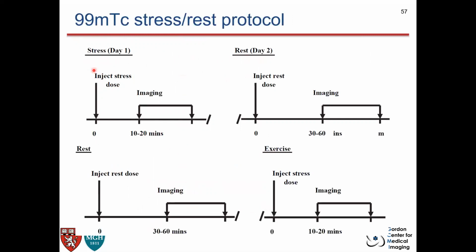If there is a 2-day protocol, in day 1 you do a stress dose, and then 10 to 20 minutes later, you start the acquisition and get the acquisition done. And the second day, inject the dose, wait 30 to 60 minutes, and then start acquisition. Right?